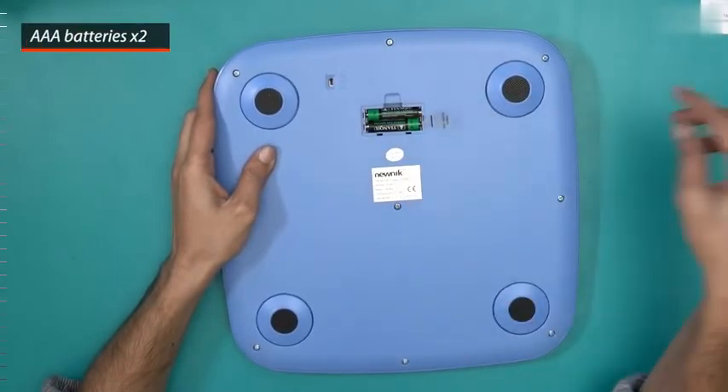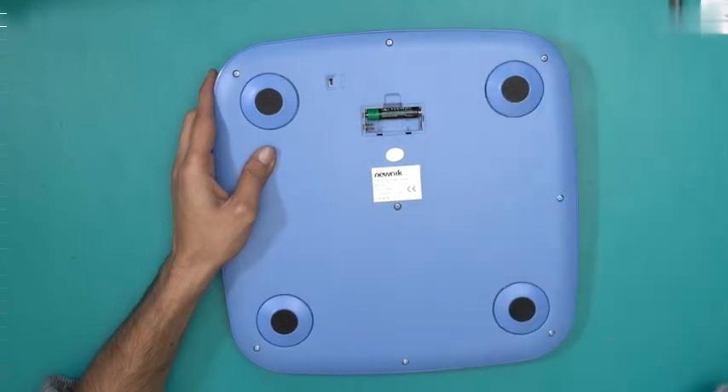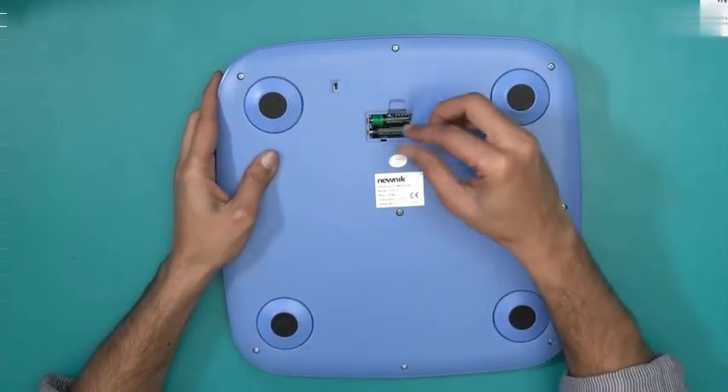And this is where the batteries are. These are the two AAA batteries that operate this particular device. But this plastic strip is preventing it from connecting, so let me just remove that and put the battery back in. Almost immediately we have display.